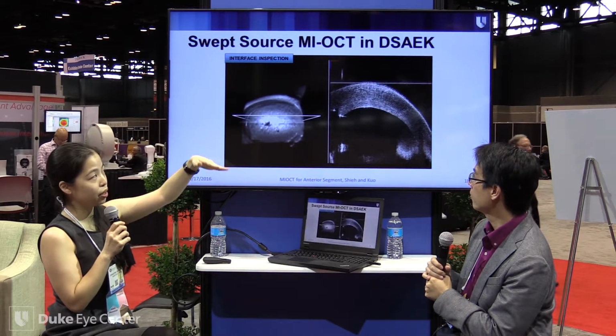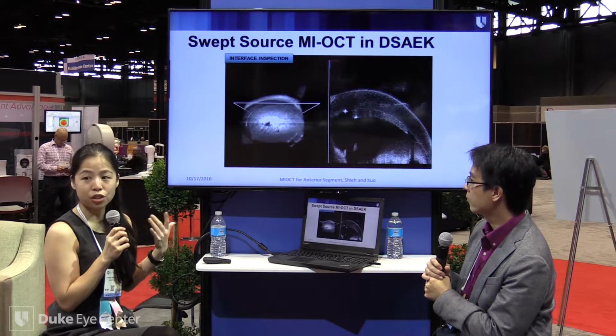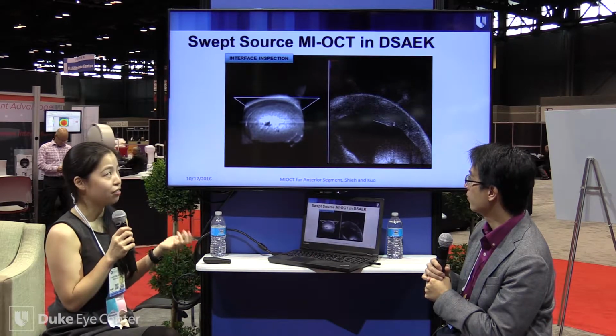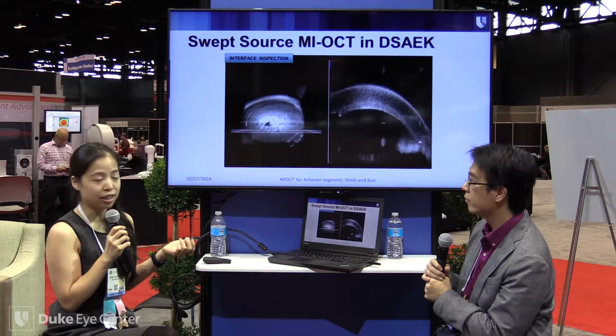And this is a scan going throughout the entire cornea showing that there is no interface fluid. The surgeon can therefore leave the operating theater feeling confident that there is no fluid and that there is very unlikely chance that the graft will detach.